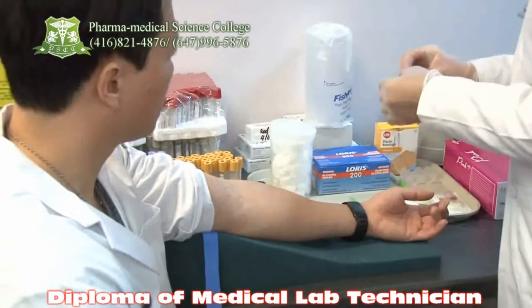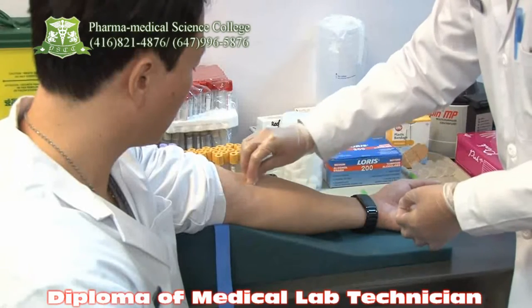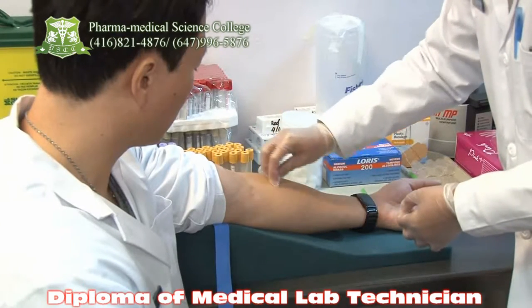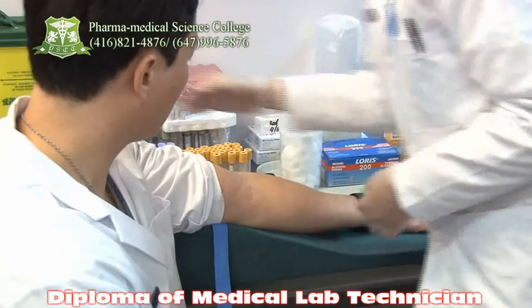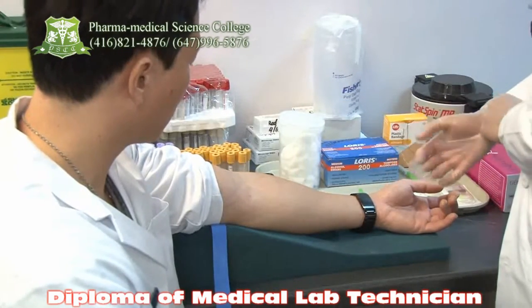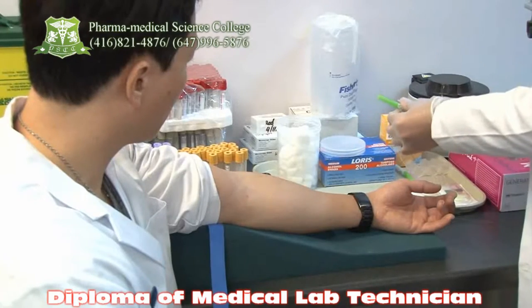She is going to use a 70% alcohol pad and she is going to clean the area, which is the medial cubital fossa area. She is going to clean it in a clockwise position. Very good. The alcohol pad has to be discarded in the biohazard bag which is assigned to it.